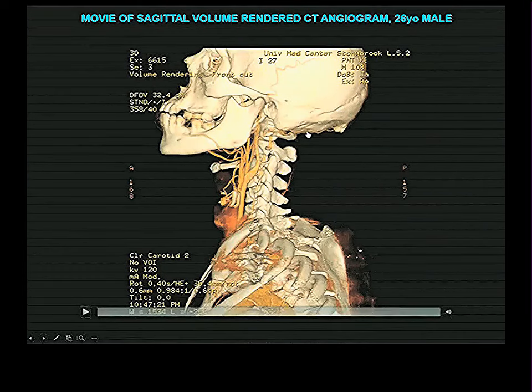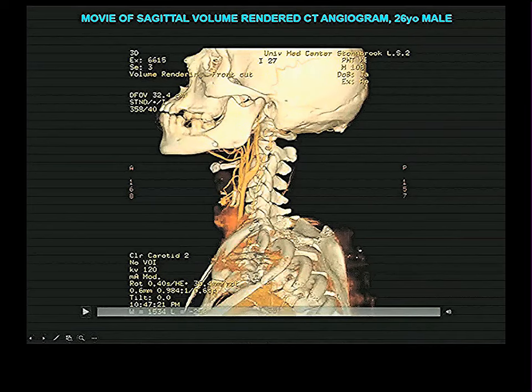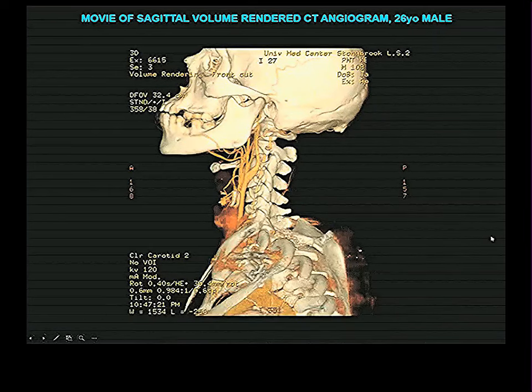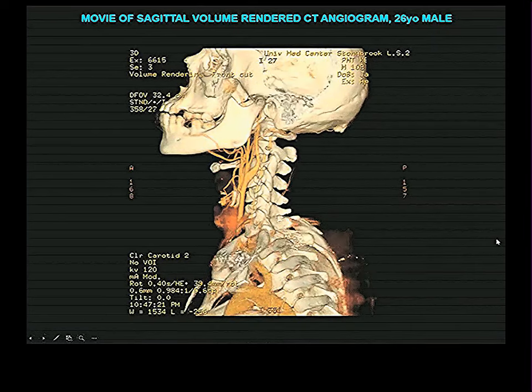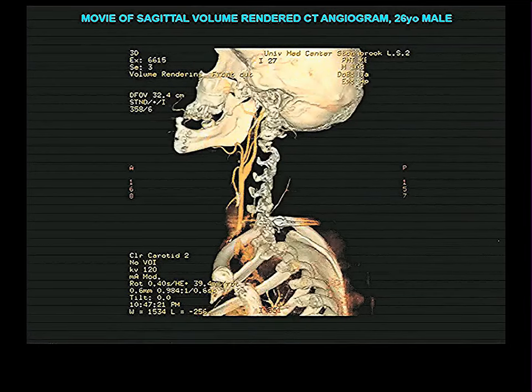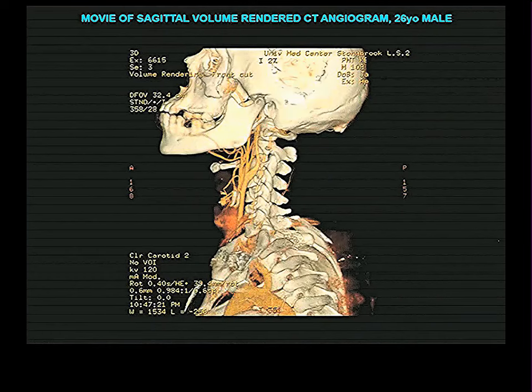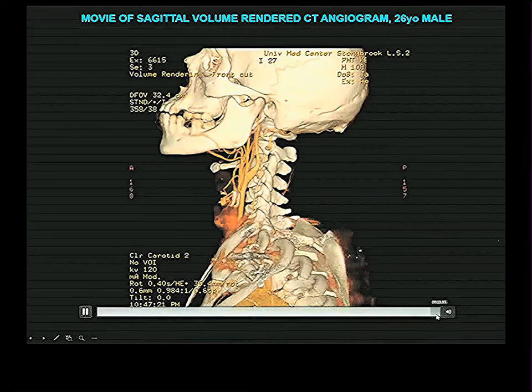Some things we can see here is an artery running right along the inferior surface of the occipital bone, which in fact is the occipital artery from this person's left side. We can see an artery here which is crossing the mandible. That's the person's left facial artery. But let's take a look at this going from left to right. Coming back again, it's the person's right carotid axis, left carotid axis. Because of the overlaps of the carotids, you really can't see things that well.